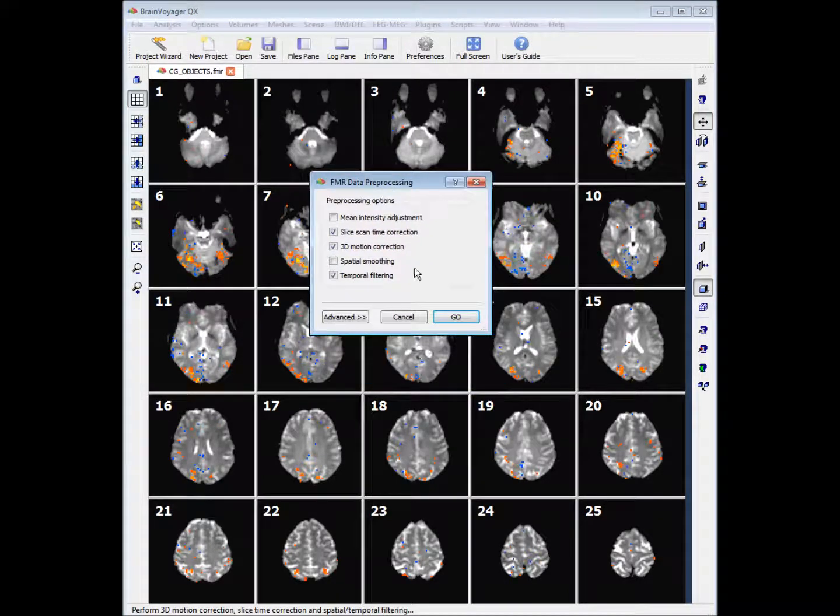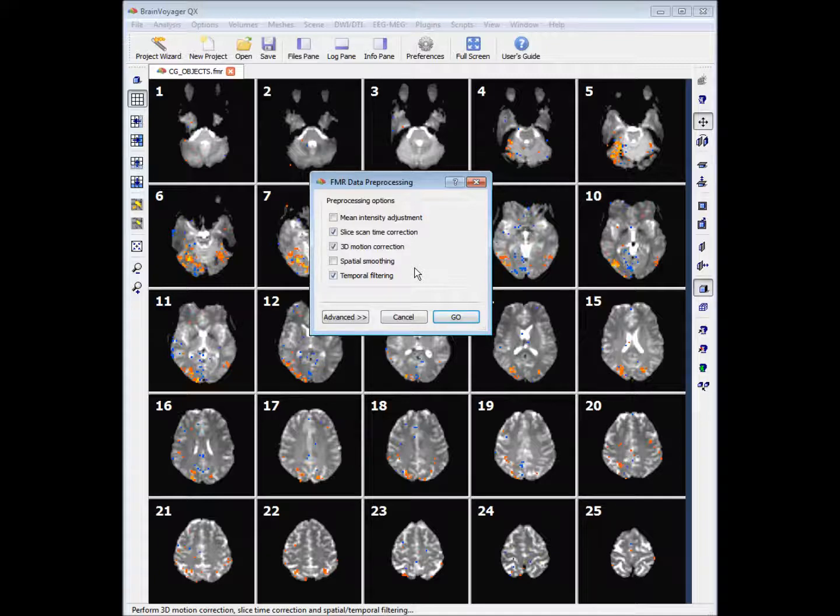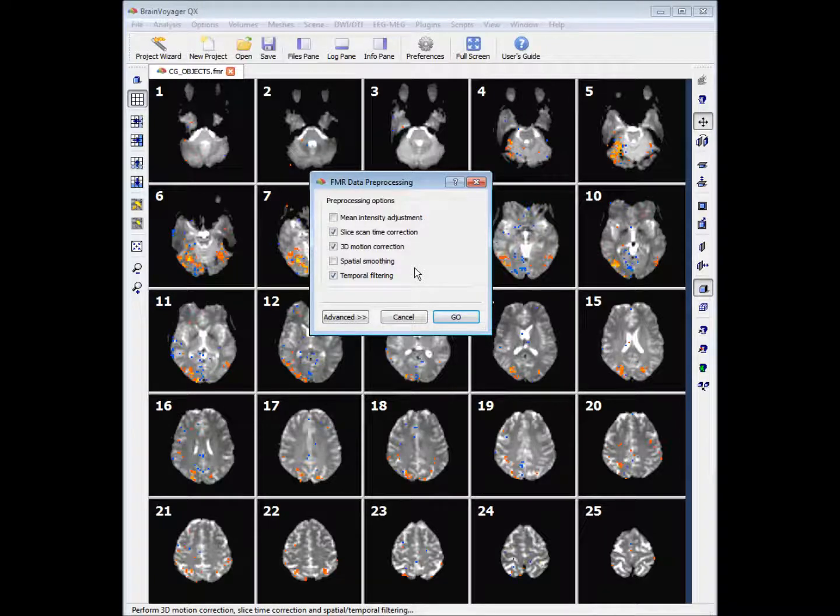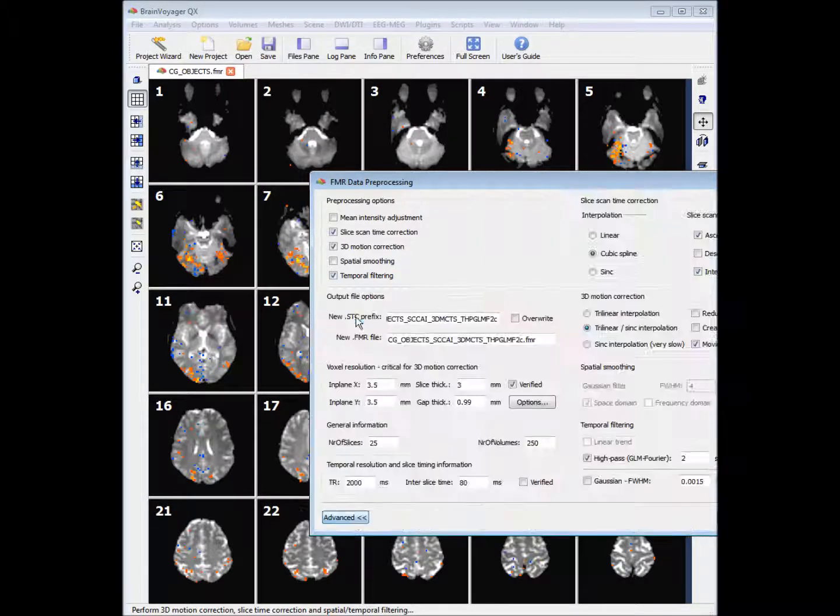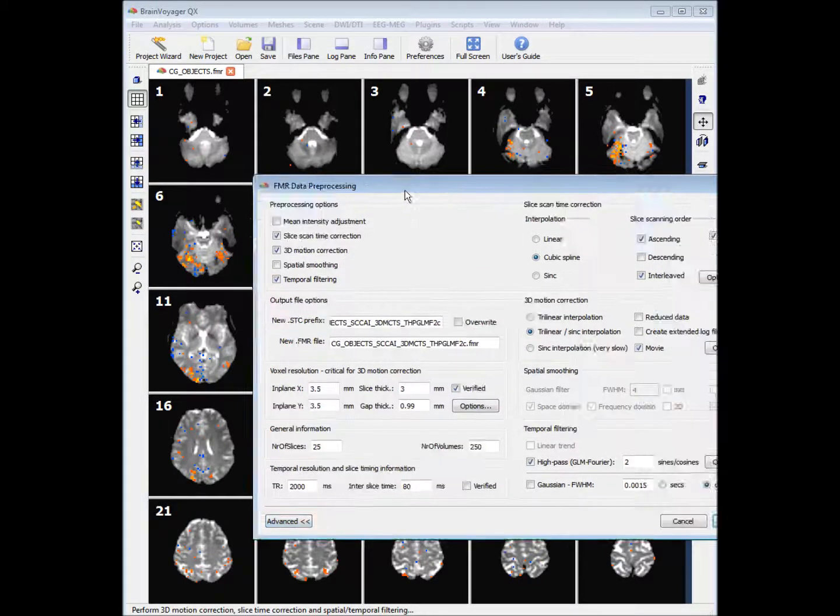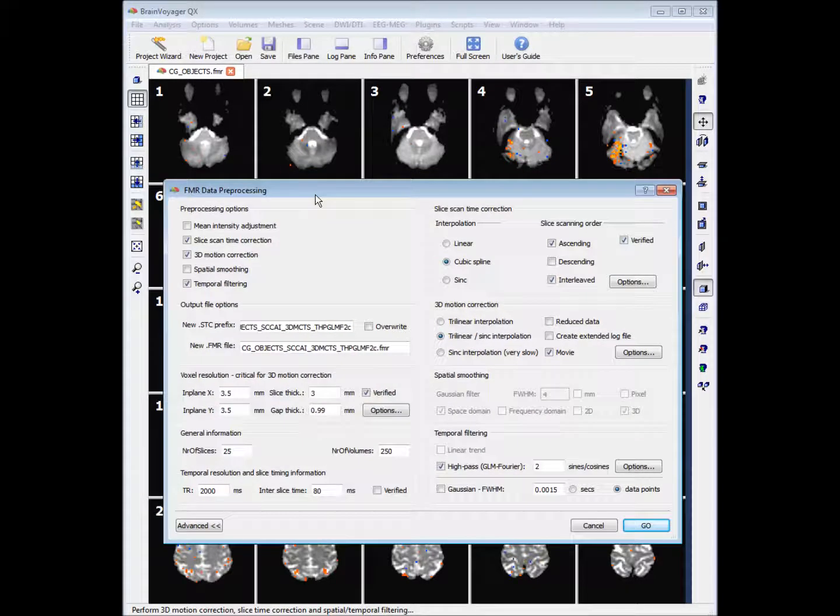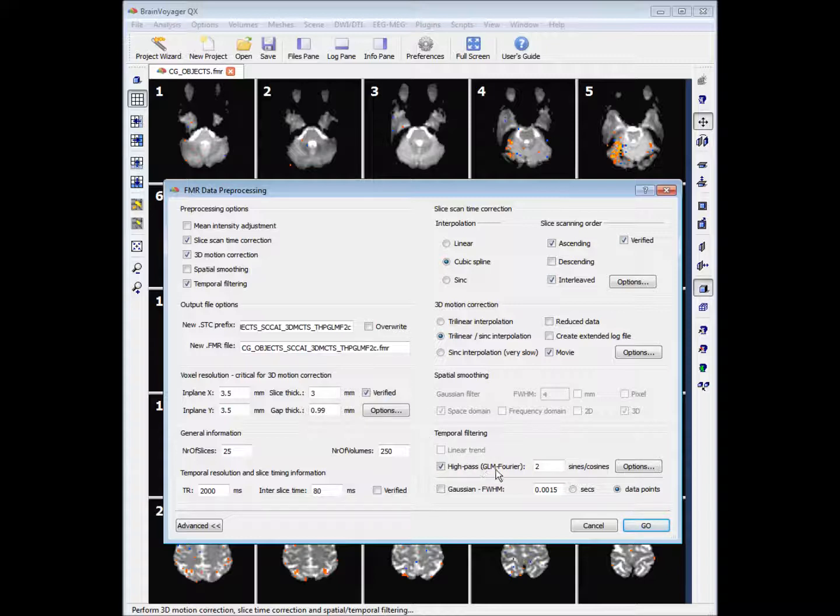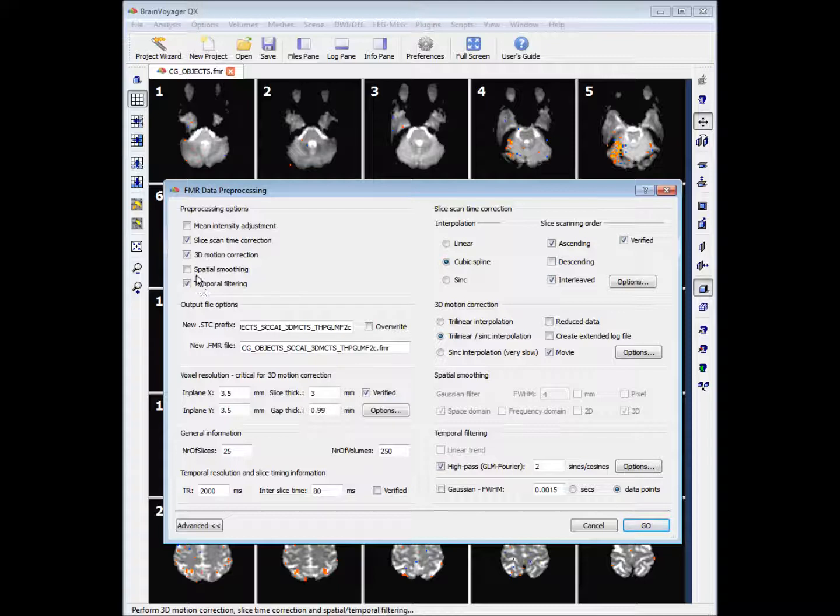We get a window that gives us some pre-processing options. What pre-processing steps you use would depend on which lab you work in. For example, our lab does temporal filtering, but because we scan with lots of slices, our high-pass temporal filter is normally around six or seven sine cosines. But for the purposes of this tutorial, we will leave the defaults as they are and select the bottom four pre-processing steps and hit go.